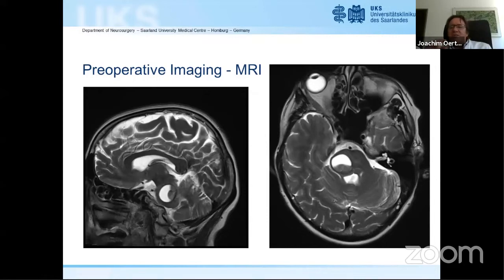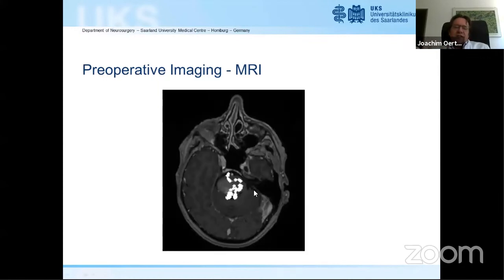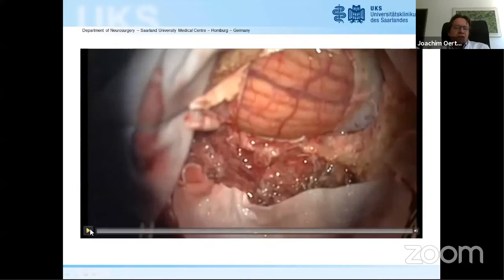The cyst might be a post-hemorrhagic cyst, whatever the reason for the hemorrhage was. So in this cyst, you can manipulate, and when you are within the cyst, you don't harm the brainstem. So I think if you plan a procedure, probably this is the best time. If you think you don't have to do any procedure, then of course you can wait and see. And then we see here that this is a very nice corridor to come above the trigeminal from the retrosigmoid to go in. Okay, so this is what we did.